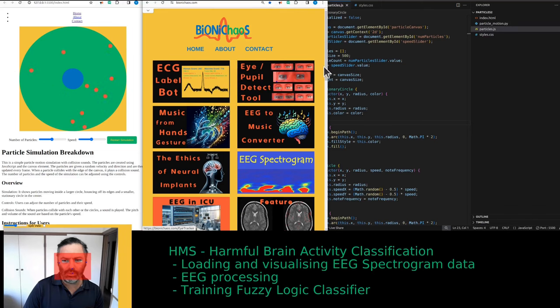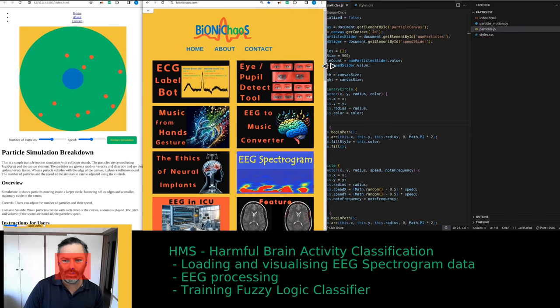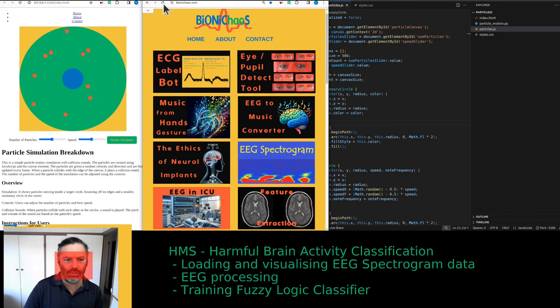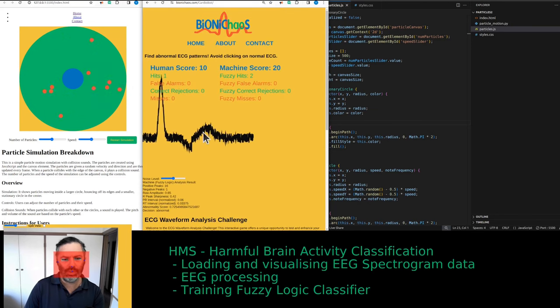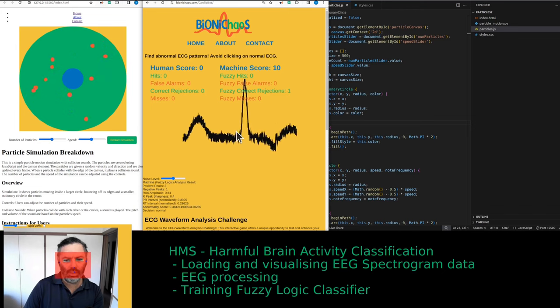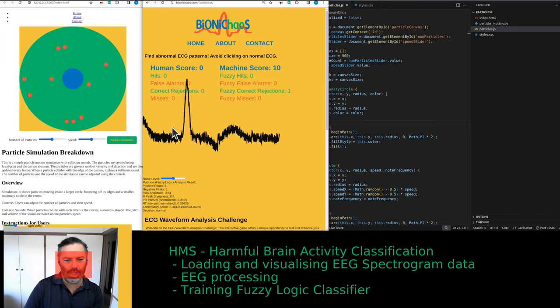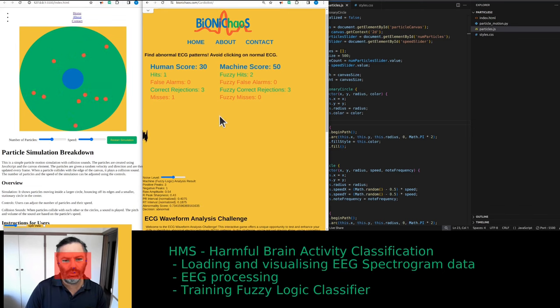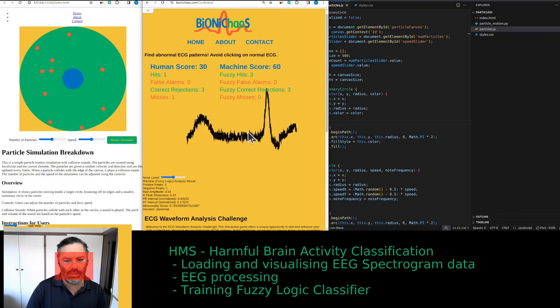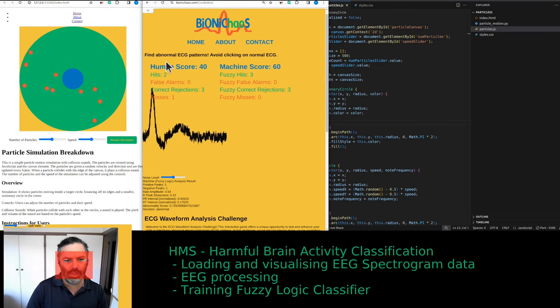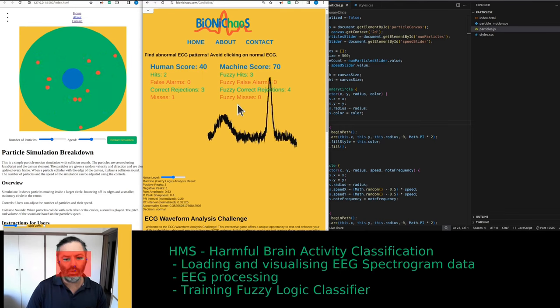If you haven't checked bionichaos.com, please go do so. There are a lot of interesting tools. One of the more recent ones is this ECG game. This tool scrolls different ECG waveforms on the screen, and you're meant to click on which one is abnormal.